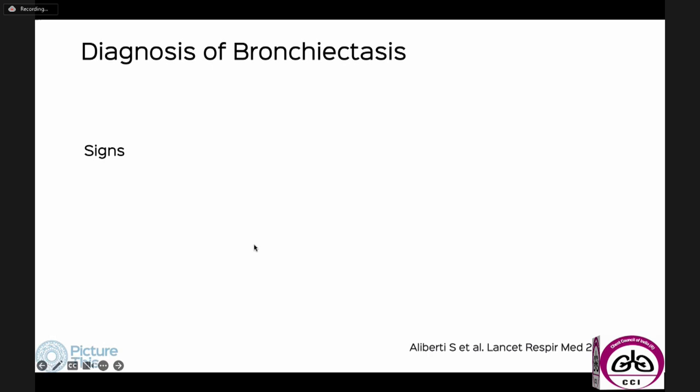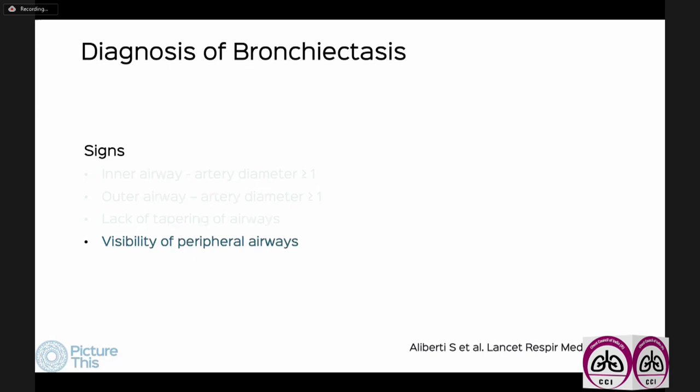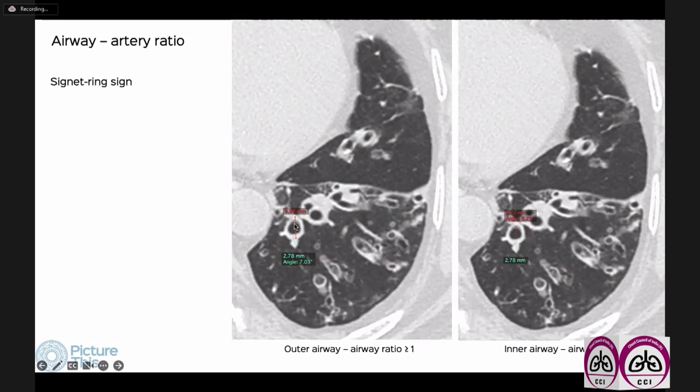The primary signs used to diagnose bronchiectasis are: airway-to-artery diameter greater than one — whether measuring inner or outer diameter doesn't matter — lack of tapering of airways, and visibility of peripheral airways. Let's look at each of these.